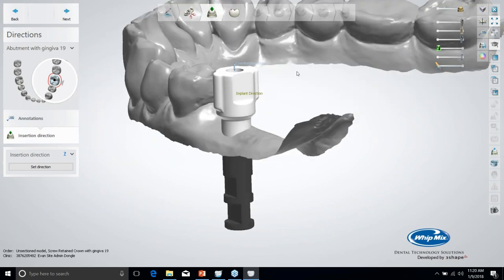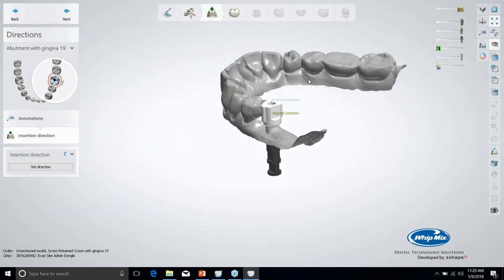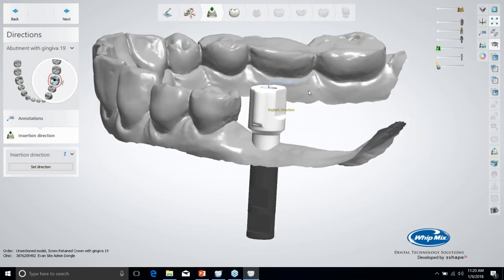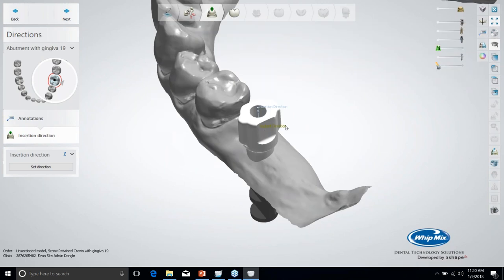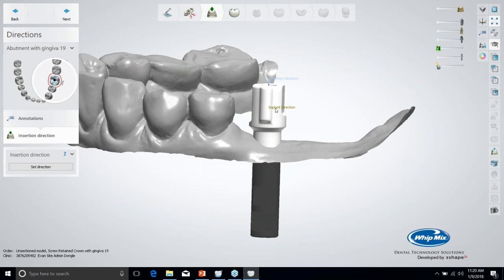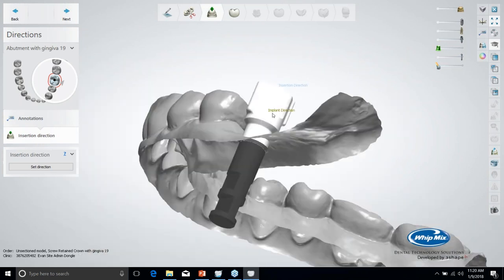So this is what, if I had this impression or stone model poured up and I had an analog in it and scanned it using a lab scanner, then with NT Trading, this is what their scan body looks like. So I would have screwed that in, scanned, and now it's given me that location of the implant.